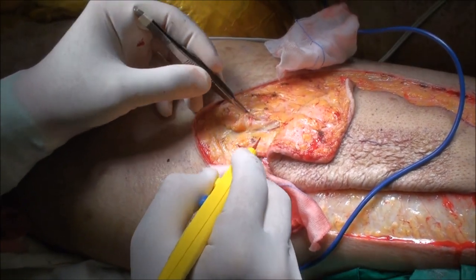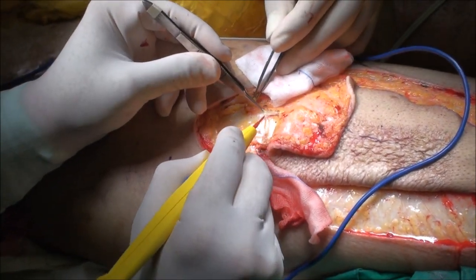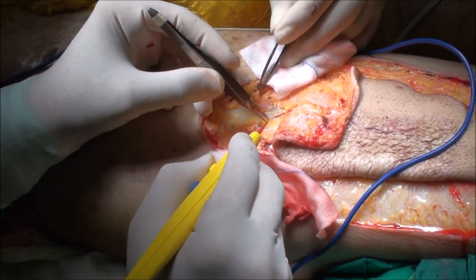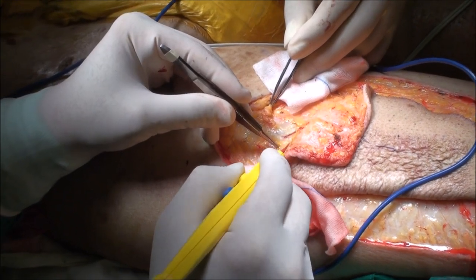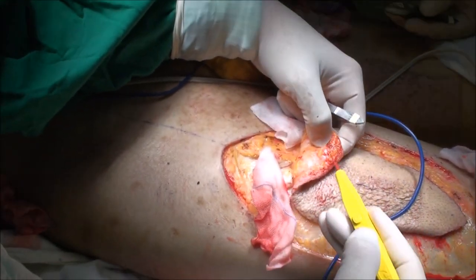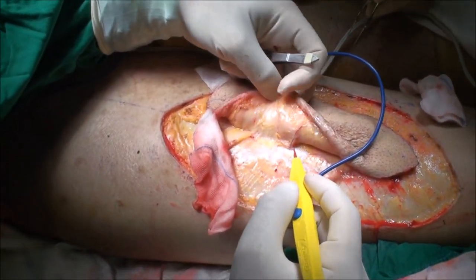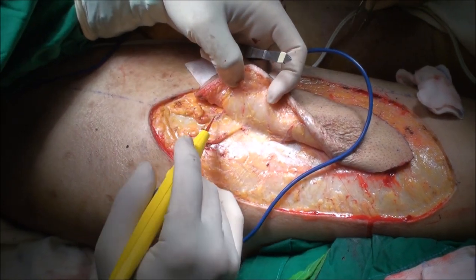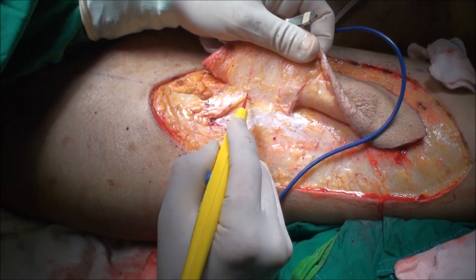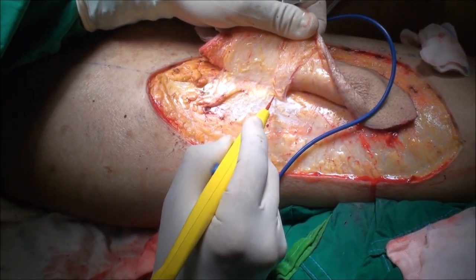Here we are using the monopolar bovie and the Colorado to dissect the perforators in the subcutaneous pathway. Now with the cutting mode with high power, it really allows not only to cut the tissue but also to coagulate the many branches coming out from the perforator. Especially in the subcutaneous portion where you see multiple small branches originating from the perforator, the cutting mode at this high power allows good coagulation.